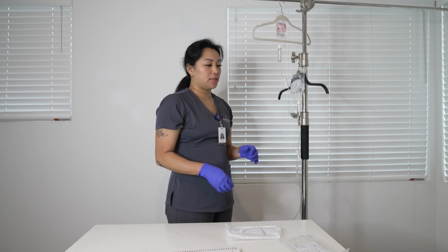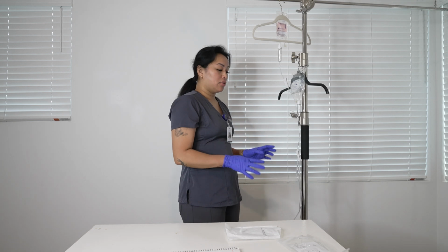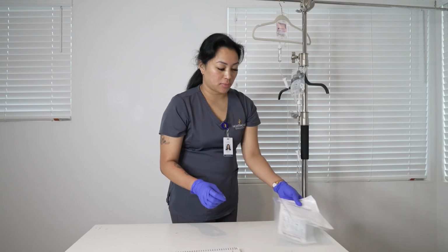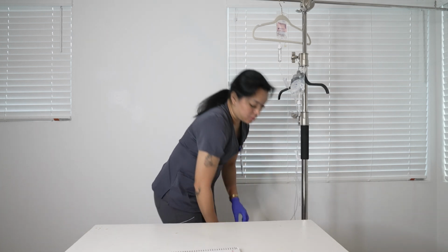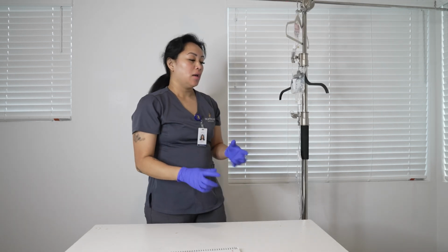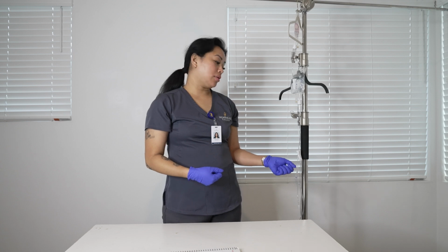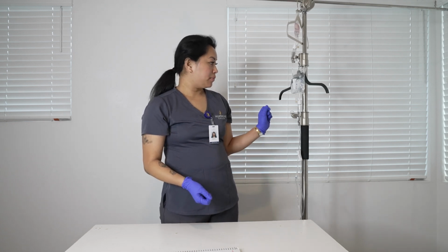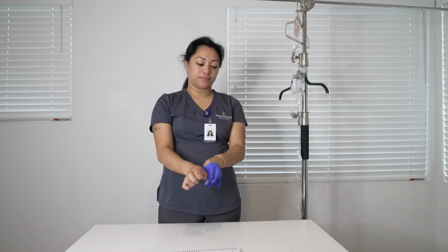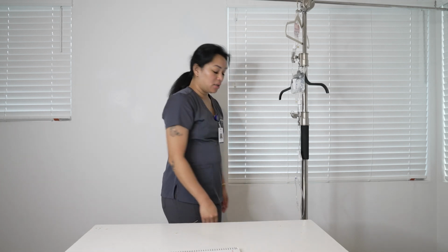and make sure that there's no redness and the patient is comfortable. He or she is good. And now I'm going to clean up, throw these away. We're good. So the patient is good. I give the patient his or her call light, and they're hooked up, and I will take off my gloves, throw it in the trash, and now I'm going to wash my hands, and then I'm going to document what I have just done, and we are good.